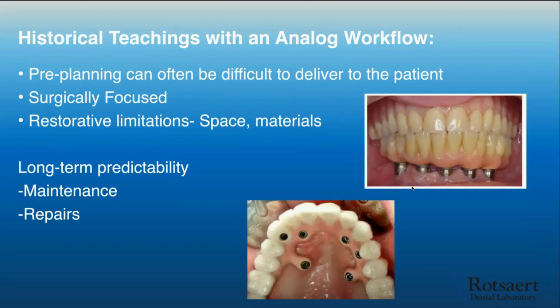But that patient was functioning on 4 because we didn't have angled components. We didn't have the various laboratory solutions we have today. The photo on the bottom is actually involving what they call zygoma or zygomatic implants. You'll see more of these, or Z fixtures, that some of the newer companies are using as their term, but they're anchored in the zygomatic process and they emerge on the palate.